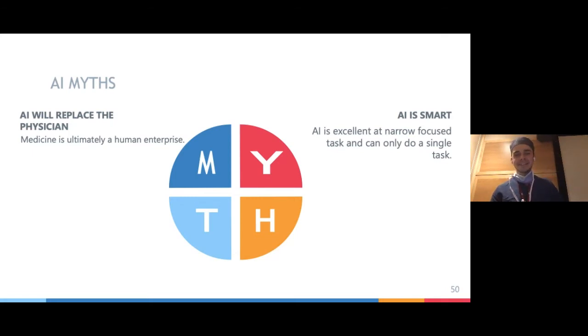So if I take my ECG example from before, we trained the AI algorithm to read the ECGs and show 46 diagnoses. Well, if there's a new disease that can be diagnosed by the ECG, for example, COVID, AI is not going to be able to figure out that this is COVID and it's not the 46 others. It will output a prediction that maps to the diagnosis classes it was trained on. And there's no such thing as AI that can learn from the environment or have some consciousness. So AI is really not smart. We can see it as a very advanced statistical analysis program.